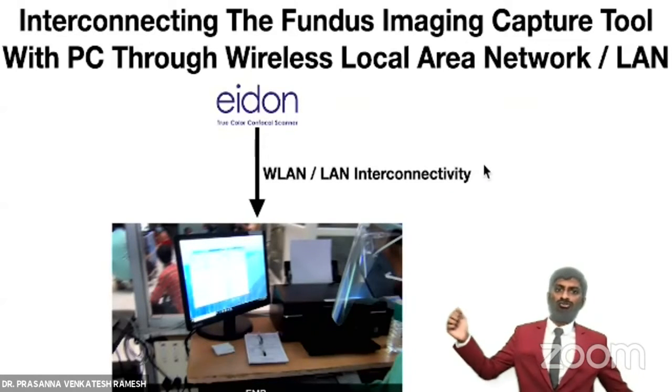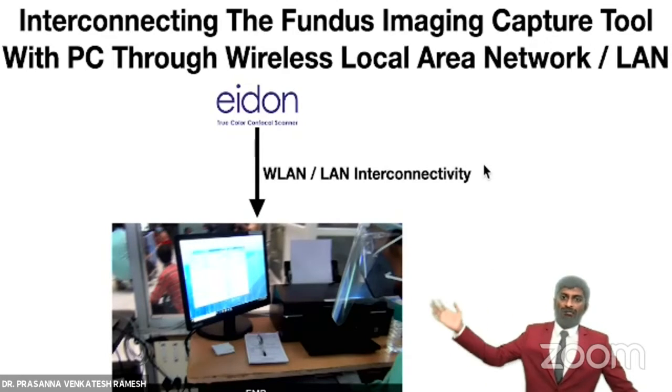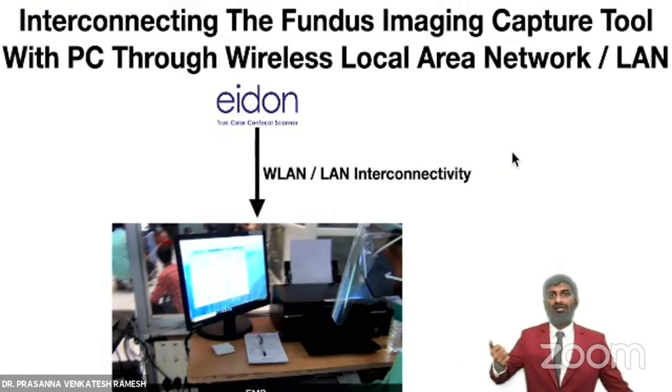So if you have a wireless web interface, then you can go for wireless, or you can use a local area network to establish the connection from the machine to your PC desktop so that the screen mirroring takes place.